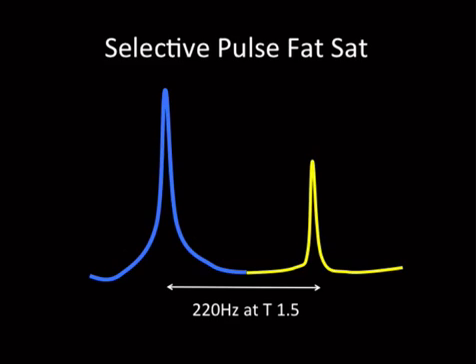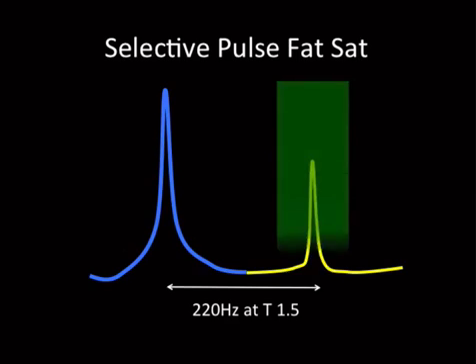So what you can do is place a saturation signal, a 90-degree pulse, or a pre-saturation pulse. You can apply it right at the precession frequency of fat, boom, to the entire field of view.